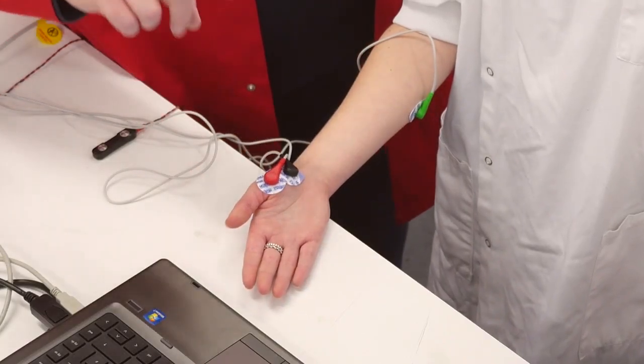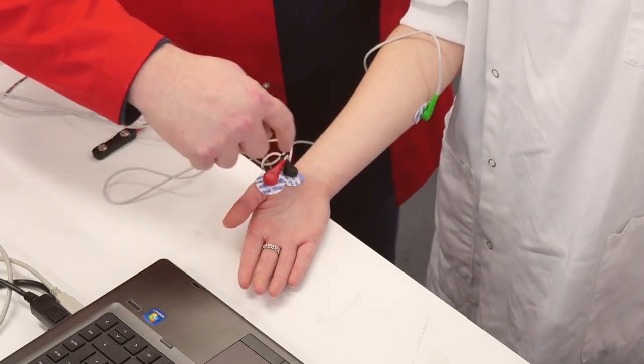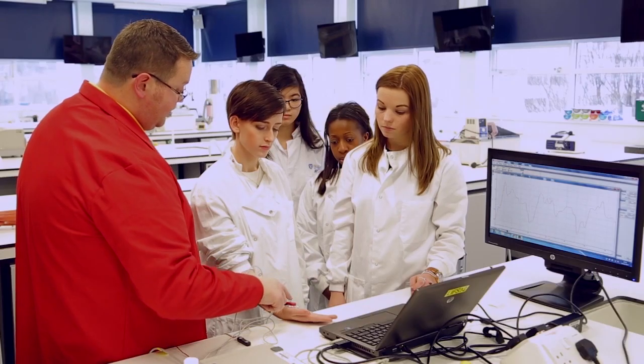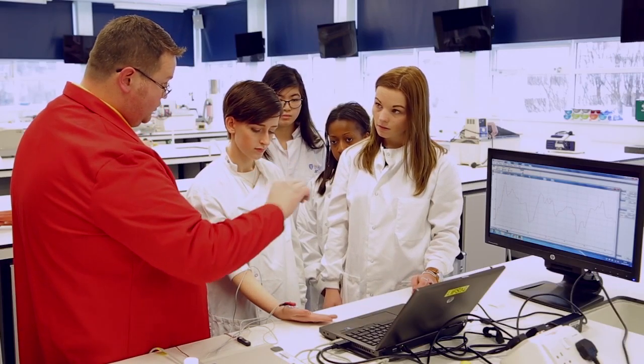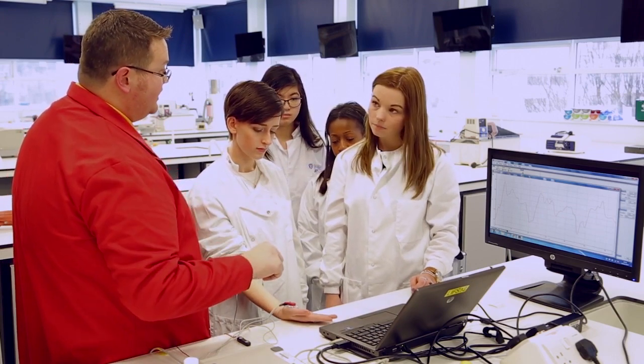We can now use that to be able to stimulate the median nerve, which will specifically cause the contraction of the muscle that causes the thumb to come over into the hand. We should see a single contraction on the screen as opposed to that multiple myogenic activity.